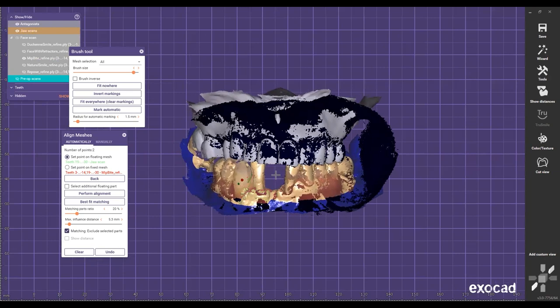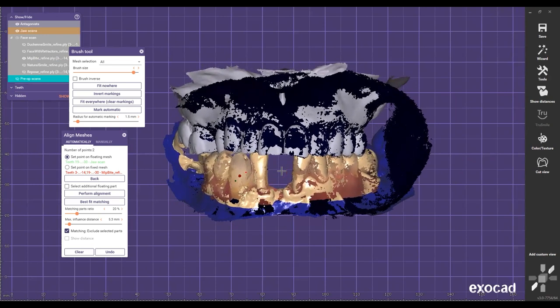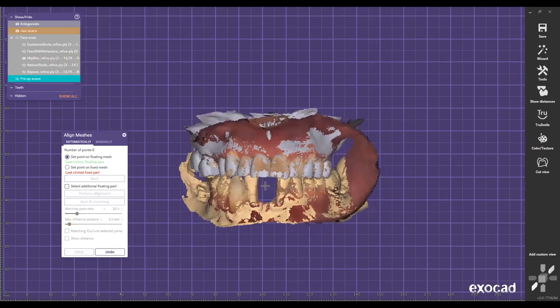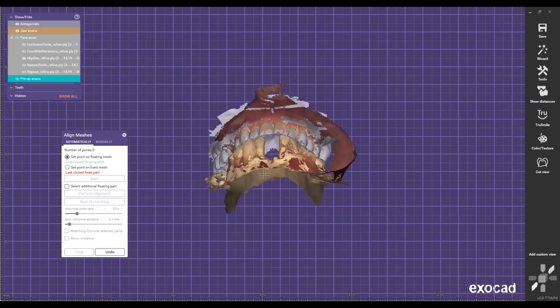We also have our methods to capture implant position, but we have more than that. We have a facial scanner that is able to get rid of canted smiles, midlines, occlusion problems, and all these things, because our scanner is able to provide more than just facial scans, right? It's able to capture bites, it's able to capture dentures, it's able to capture wax rims and all those things. So that's basically how we utilize our facial scanner.